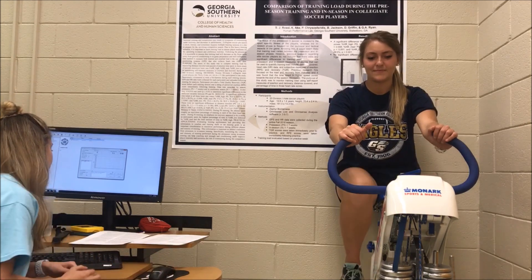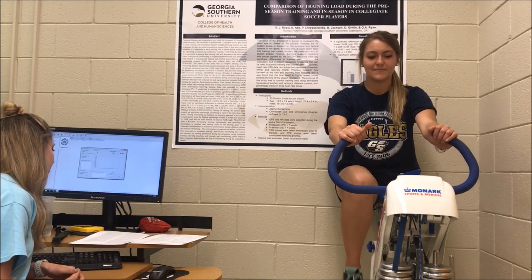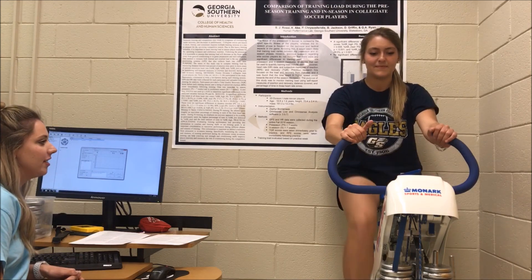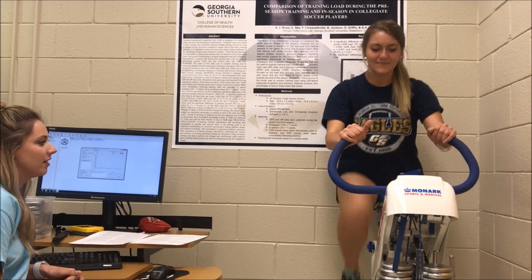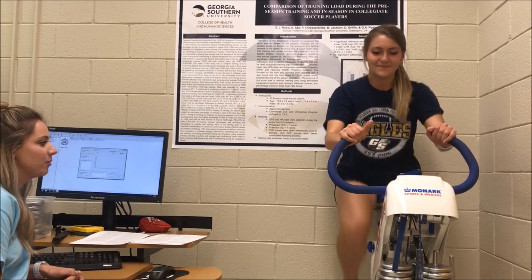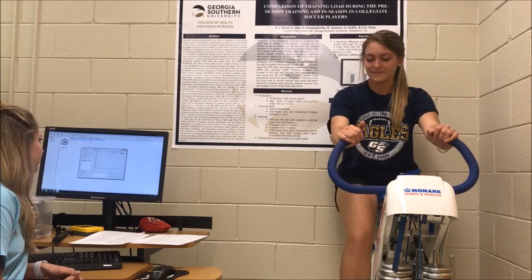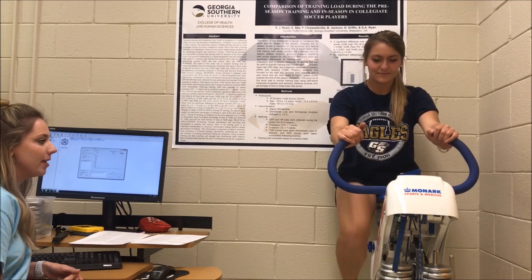We are about to hit that point where we do those 4 to 6 seconds of all-out sprinting. 3, 2, 1, go. 4, 3, 2, 1. Bring it back down to 50 to 60 RPMs.